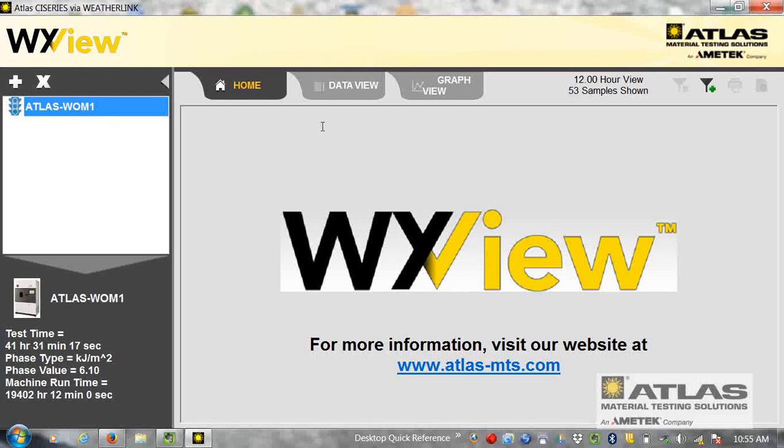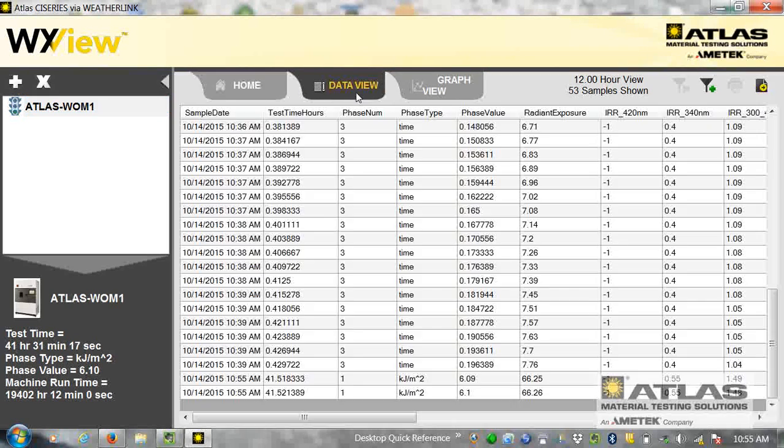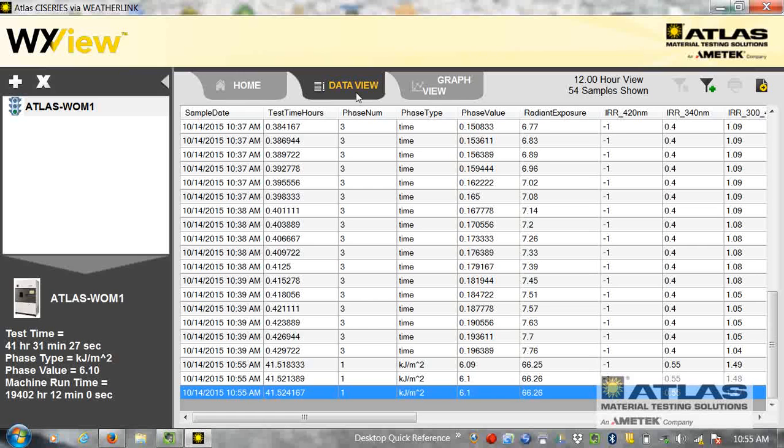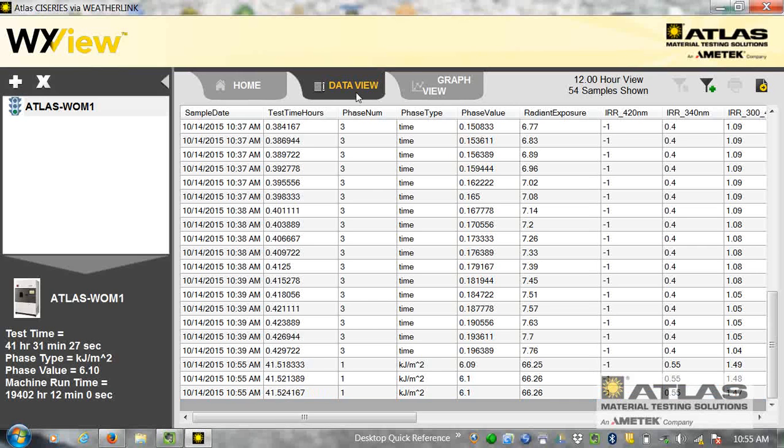So now if I click data view, here's all my data that I've been collecting, raw data. And you can see it's still collecting, the machine's still running.